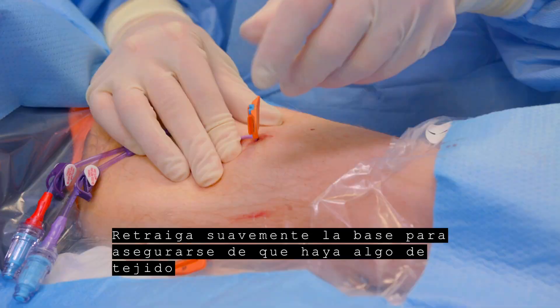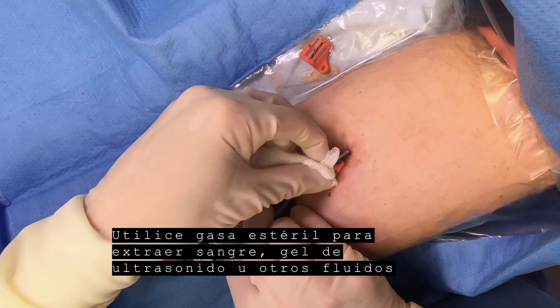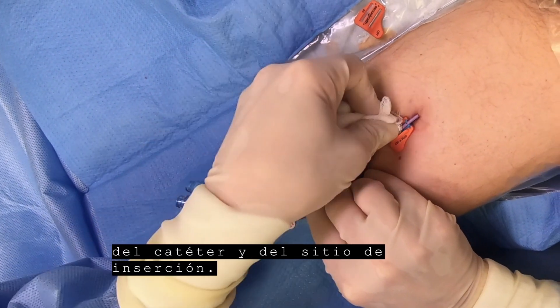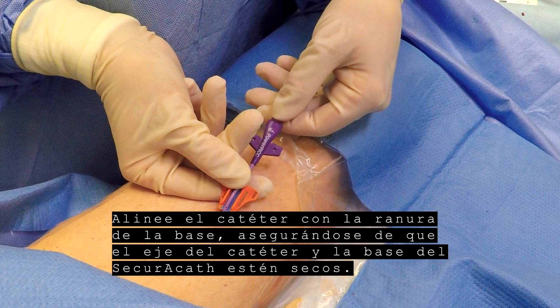Gently retract the base to be sure there is some subcutaneous tissue between the SecuraCath feet and the dermis. Use sterile gauze to remove blood, ultrasound gel, or other fluids from the catheter and the insertion site. Align the catheter with the groove in the base, making sure the catheter shaft and SecuraCath base are dry.